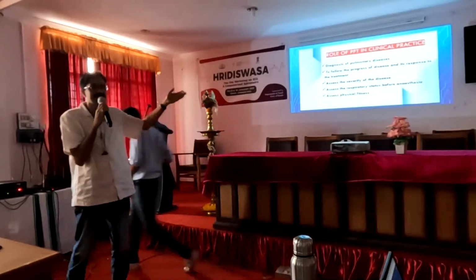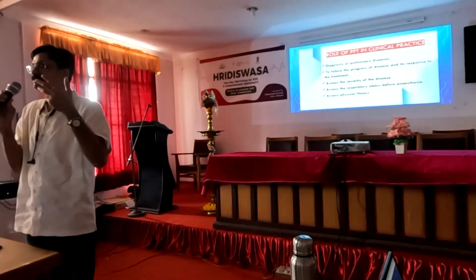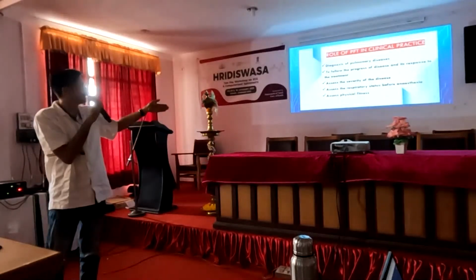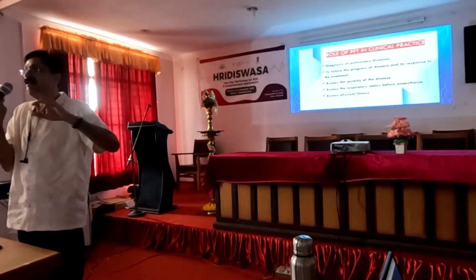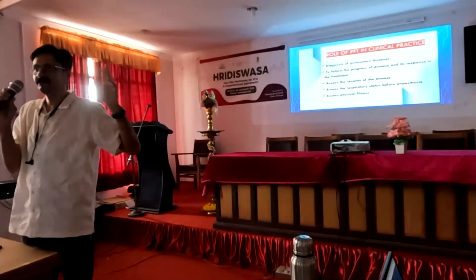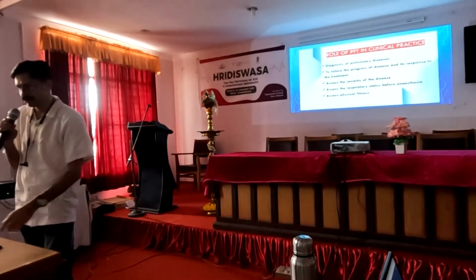Respiratory status before anesthesia: before any major surgery, we will assess the pulmonary function test. Also physical fitness: for persons in deep diving, and for military forces, we will assess physical fitness with the pulmonary function test.